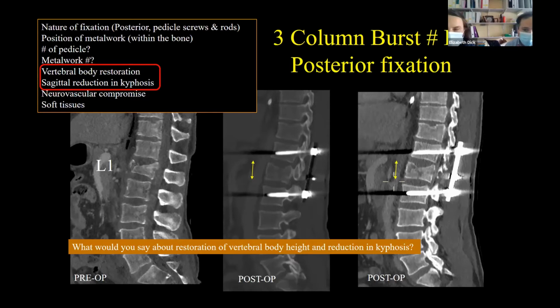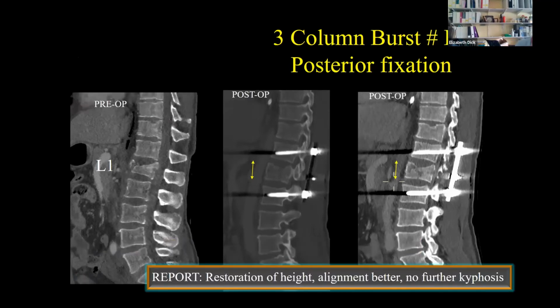But yes, for sure, in this case there's an AO fracture system that's been used, and these are slightly different pedicle screws. They go through the pedicles, but they go right to the very tip of the vertebral body, and they're called Schanz screws. This is one of the best chances of distraction you have, especially if you get to them very early after an operation, so maybe a day or two since they're fractured. You've got the best chance of trying to restore their anatomy.